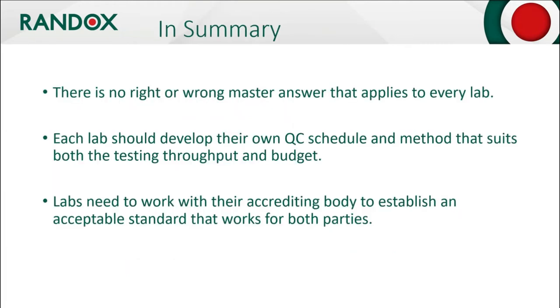So in summary, there is no right or wrong master answer that applies to every lab. So it should be up to each lab to develop their own QC schedule method that suits both the testing throughput and the budget of the testing. And labs definitely need to work with their accrediting body to establish an acceptable standard that works for both parties.